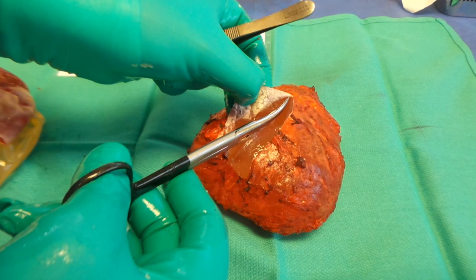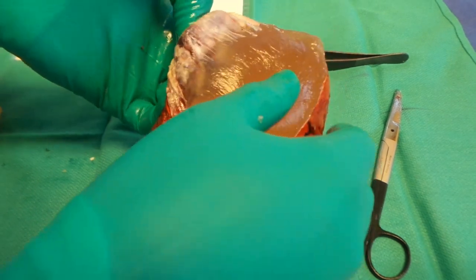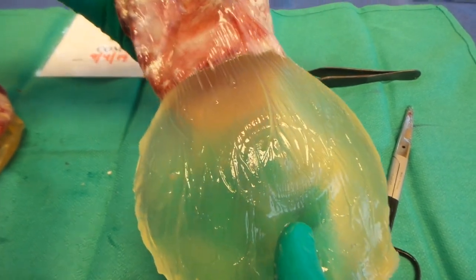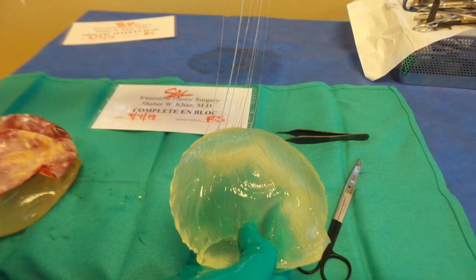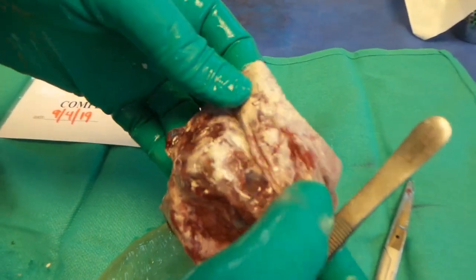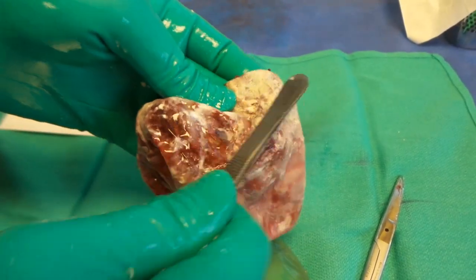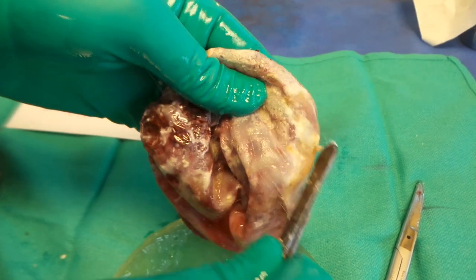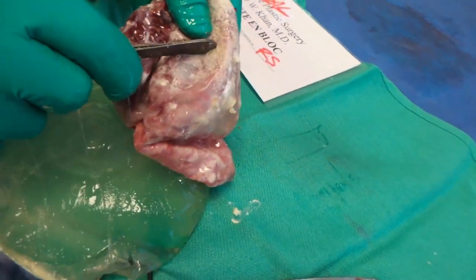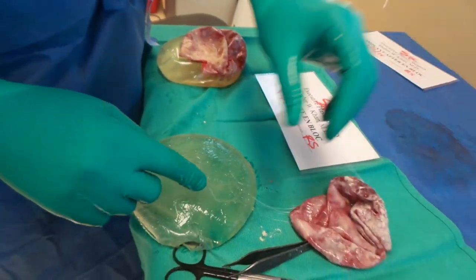This is abnormal — a ruptured implant. For the first time it's actually seeing air. Abnormal, and this is the same — it's much worse on the left side. Sandpaper type consistency. You can see all of these silica particles that have formed. It's like toothpaste, and these are hard crystals. This is ruptured as well.